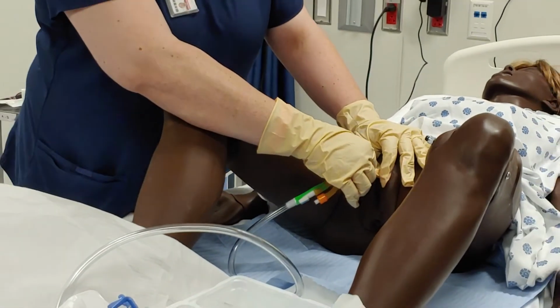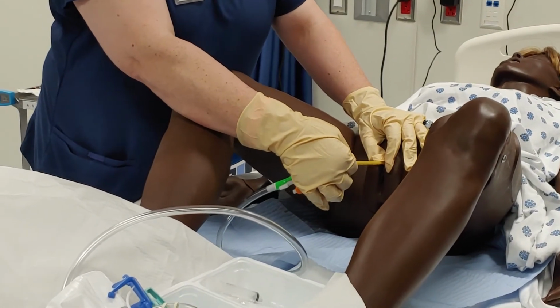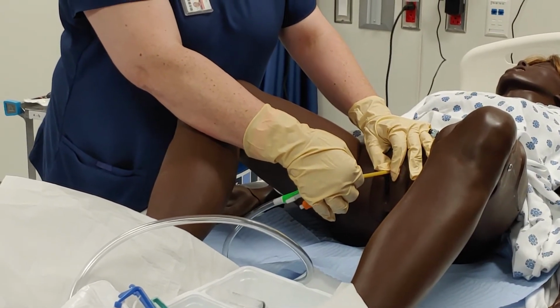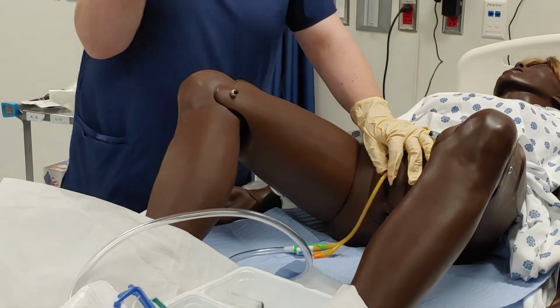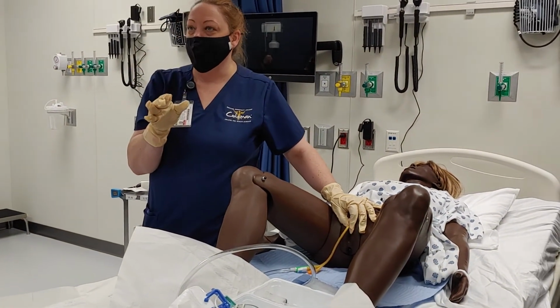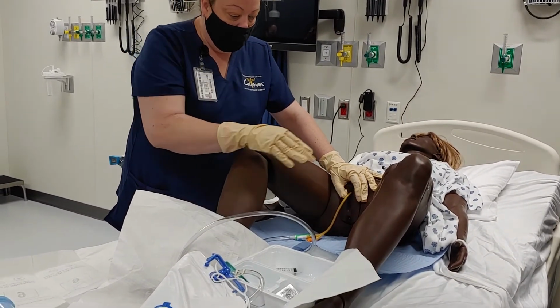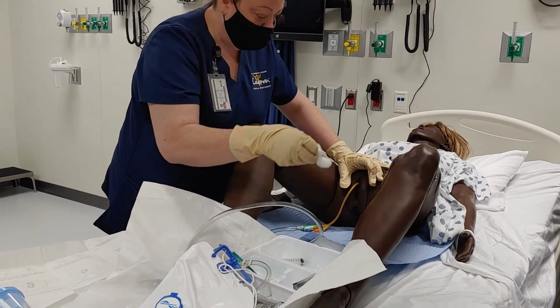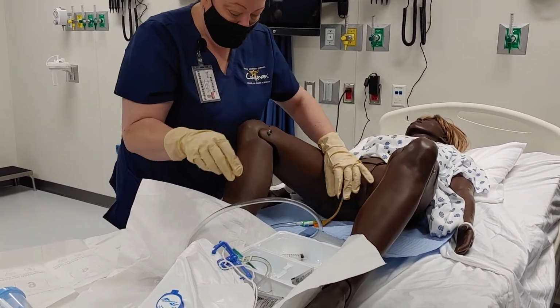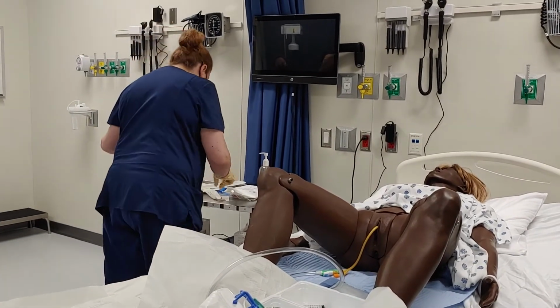Then you can give a little light tug, and you'll see that it does not come out. Okay? Because we have the balloon in there. Right? And that's the purpose of it, to keep it there without it coming back out. Right? Once we've done that, we're going to go ahead and take whatever gauze we have left and clean them up. Then we can go ahead and take a leg strap.